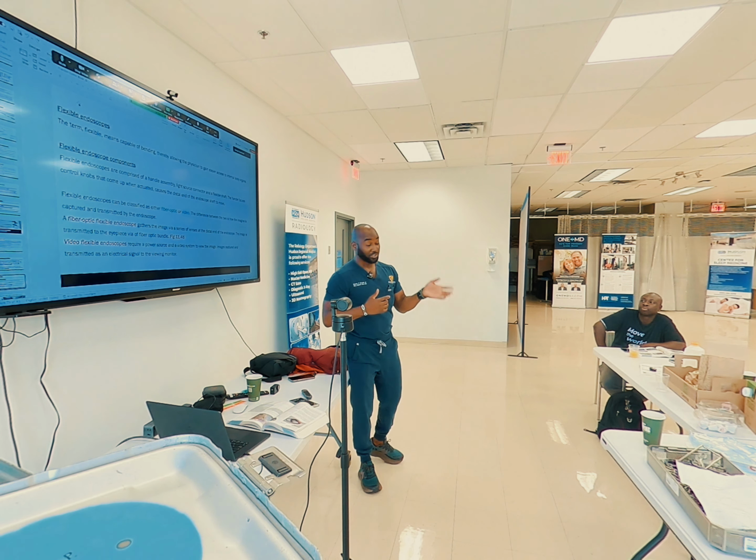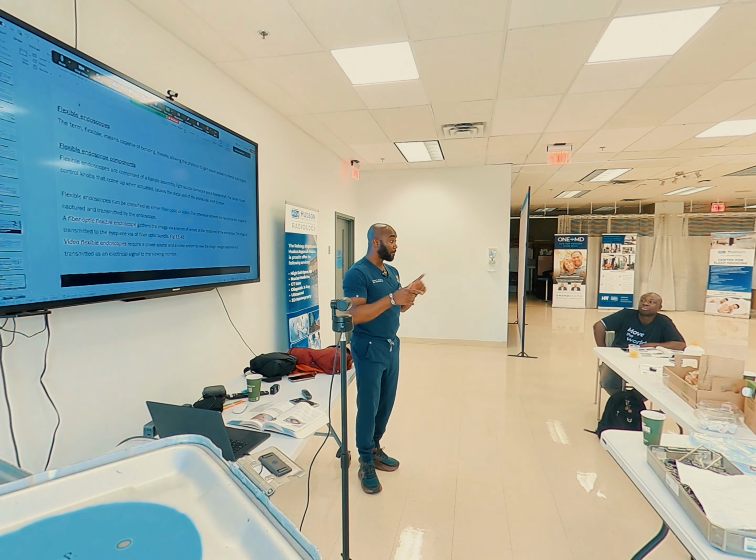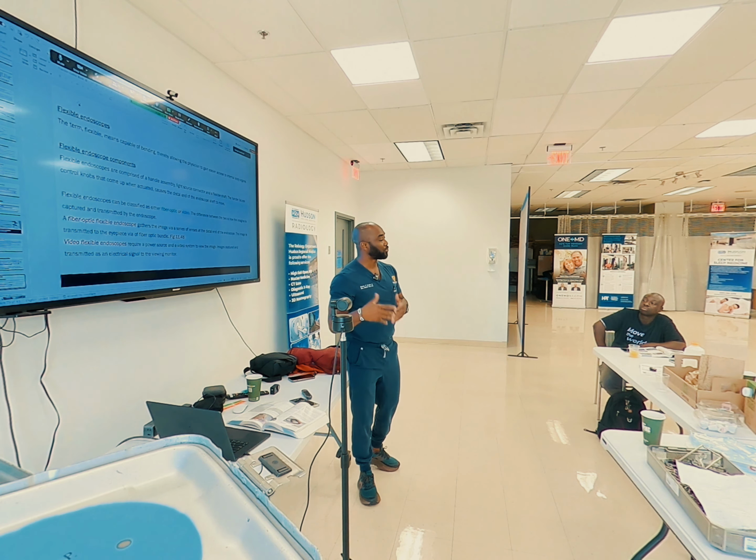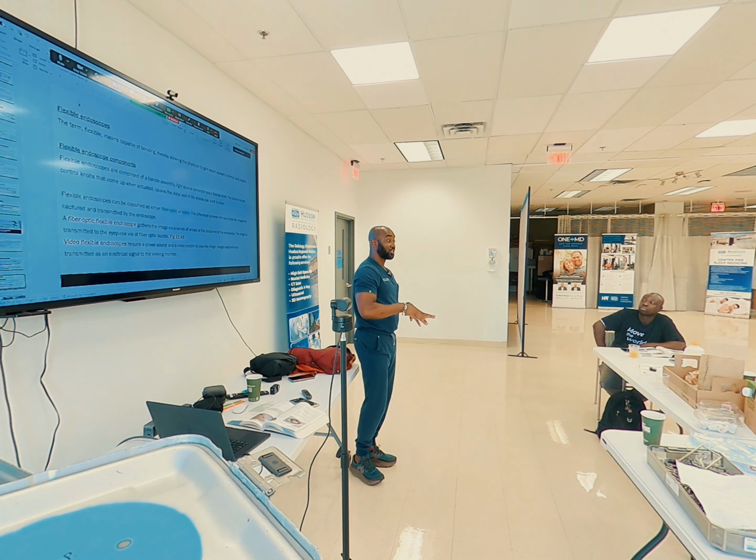I'm giving you this information so you don't put yourself into any quagmire by not following the instructions, or somebody's trying to speed up, like, oh man, I know we have the endoscopic reprocessor, but we need like 5 GI scopes now, can you manually do it? No. Your answer should be a clear no. You cannot get fired for that. And if you're fired, you call the labor law, you call the FDA. I got fired for protecting a patient, because according to these standards, I should not be doing high level disinfection for semi-critical instruments manually.